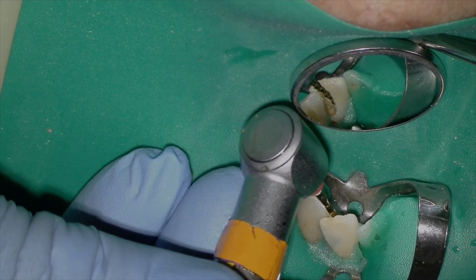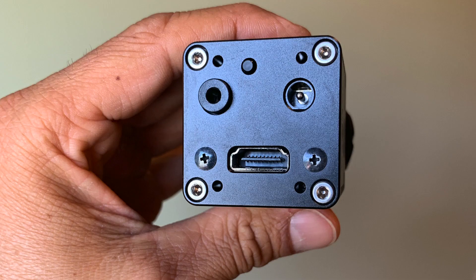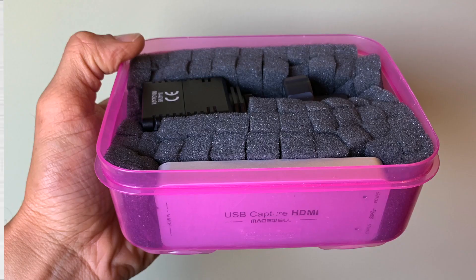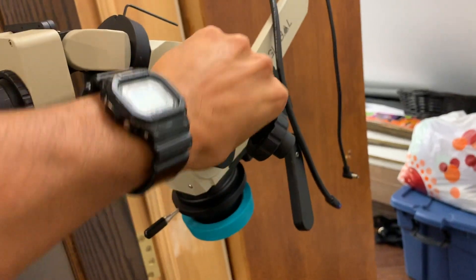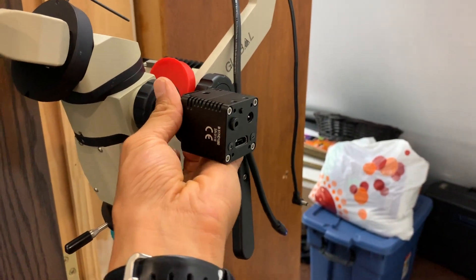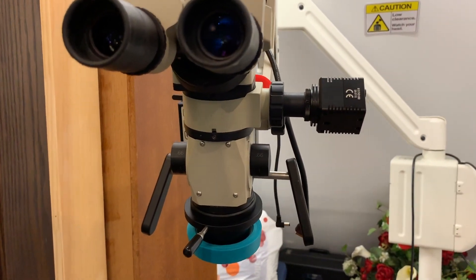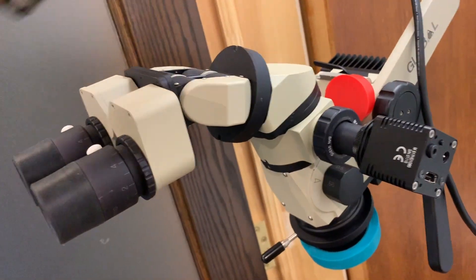Here are some stills of the video camera itself — from the side, from the back where the HDMI cable and power input are, and where the lenses are. This is how I travel around with it in a Tupperware container, because I go to a few different places. I've been using it like this for almost three years. This is a general dentist practice, so my microscope goes into the closet. I take my camera off because I have another microscope at another clinic.